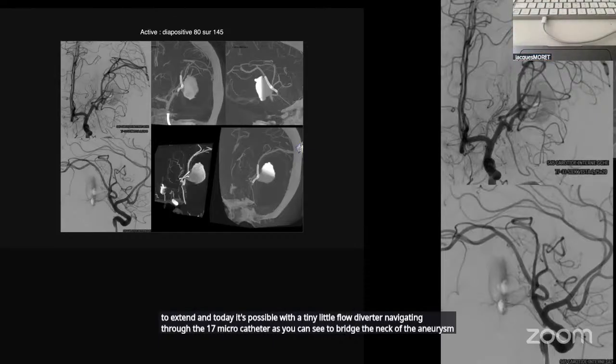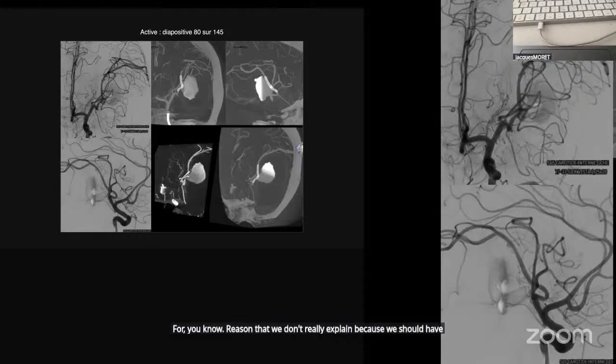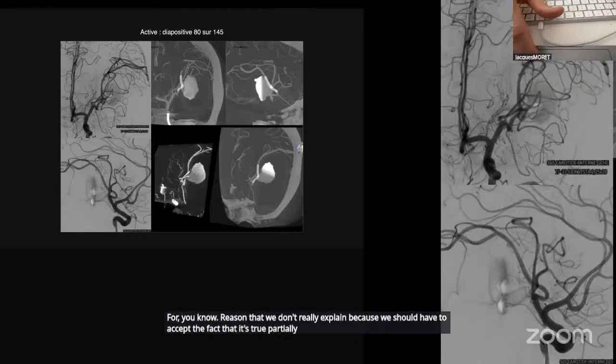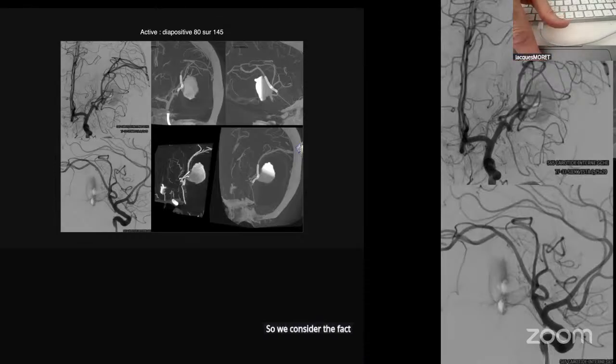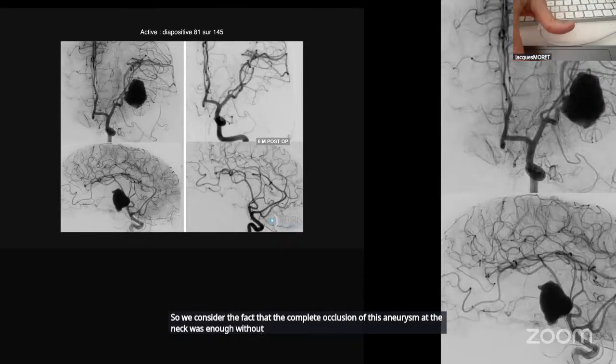We didn't put any coils inside the sac of the aneurysm, for a reason that we don't really explain, because we should have, except the fact that it's a true partially thrombosed aneurysm with a big clot, and the portion of the aneurysm which is patent is not that much. So we considered that the complete occlusion of this aneurysm at the neck was enough without delivering coils. The sac is big like that, if you follow the arrow.